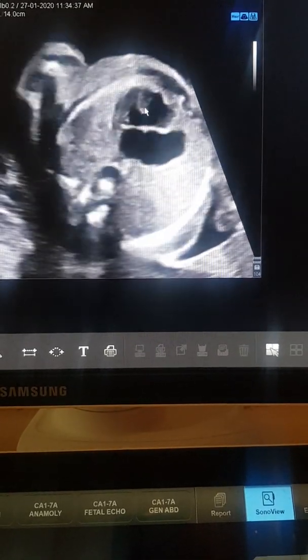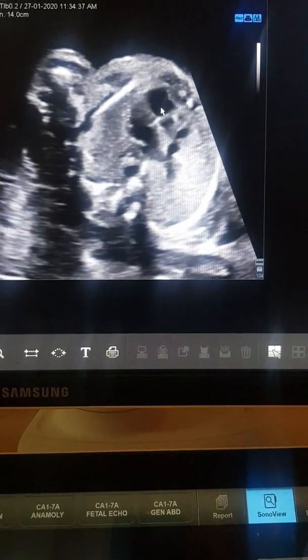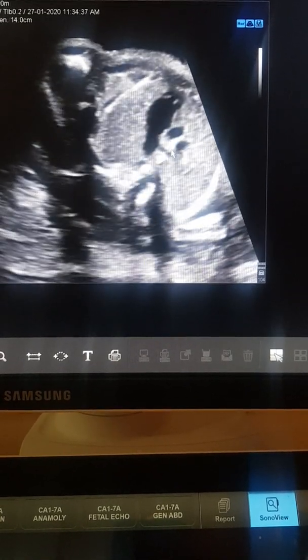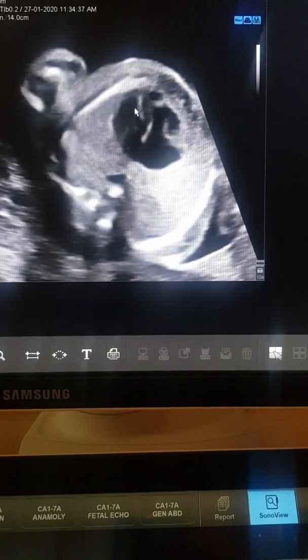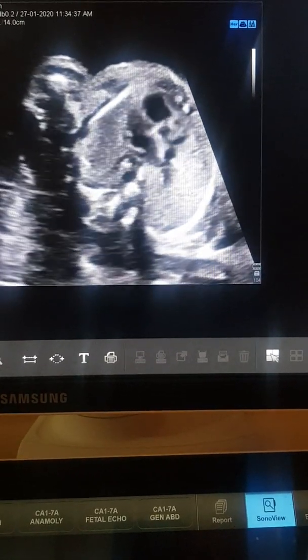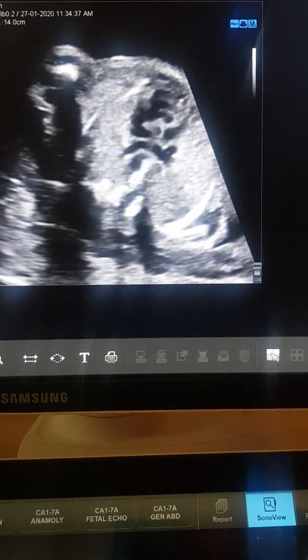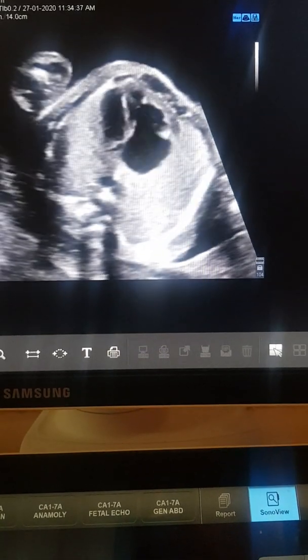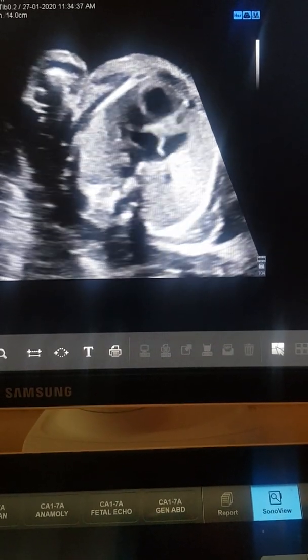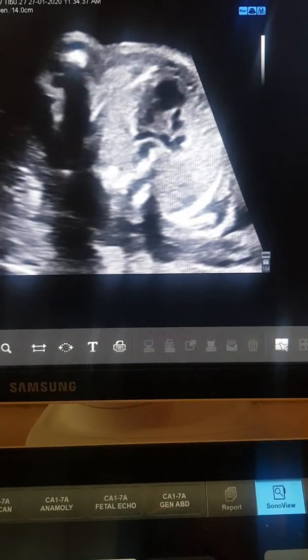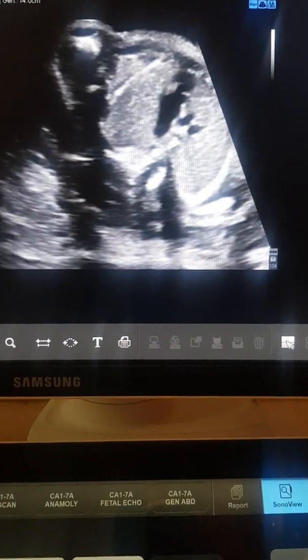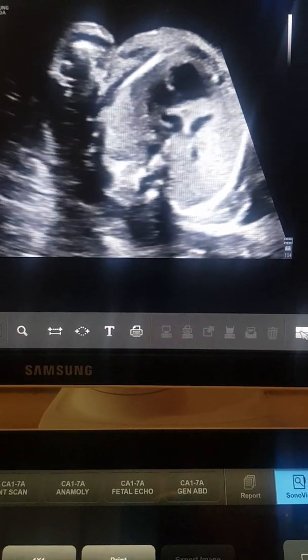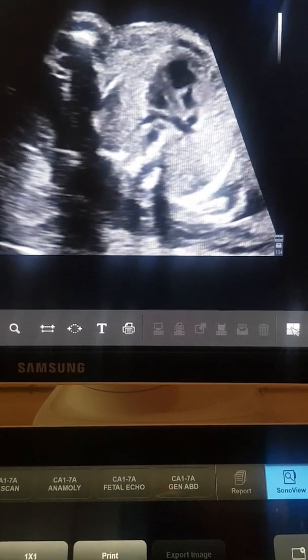The aorta was coming out from the right ventricle. Following the arrow: that is the outlet, and from the outlet comes the aorta. The pulmonary artery is also coming out from the right ventricle. It is a double outlet right ventricle, with both the aorta and pulmonary artery coming from the right ventricle. The diagnosis changed from hypoplastic left heart with a large VSD to hypoplastic left heart with VSD and double outlet right ventricle, with normal disposition of aorta and pulmonary artery.